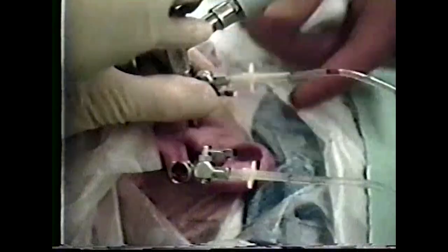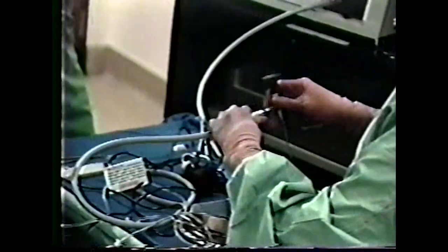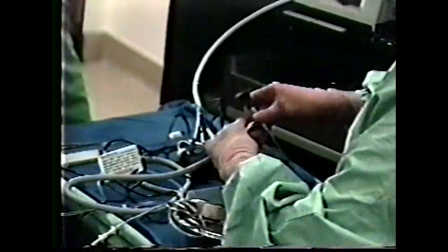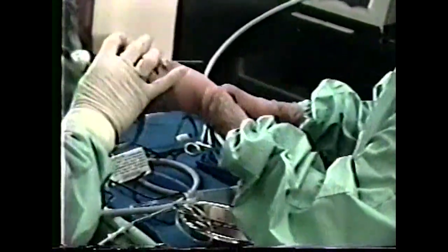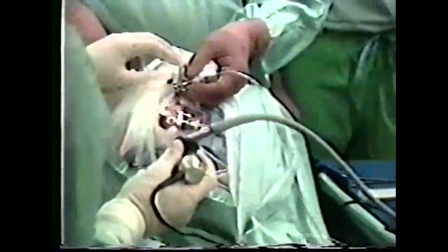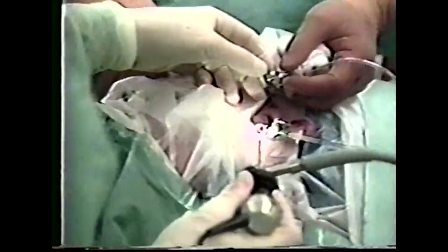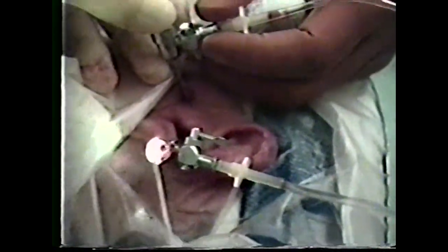The 15-degree arthroscope is removed from the camera, and a 30-degree arthroscope is put in its place. The 30-degree angled arthroscope allows visualization in the medial and lateral troughs that is not possible with the standard 15-degree scope. By rotating the scope and holding a fixed camera position, a panoramic sweep of the joint from medial to lateral can be accomplished with very little lateral motion of the scope tip. Before reintroducing the 30-degree arthroscope, the joint is flushed clear.